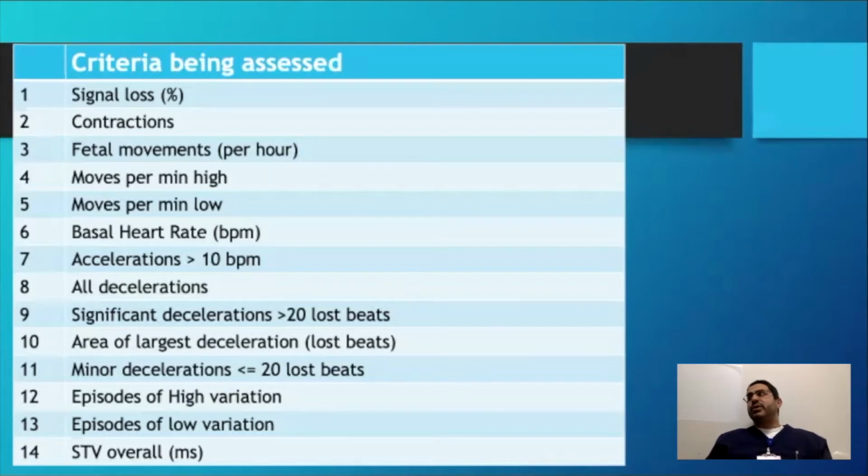Accurate or not, well, the reality is that the most the baby is going to move is the moment you start stimulating it. Okay, so the moment you put the trace on, you're going to feel more movements. It may be that this baby's not going to move any further, and that's only the 2 movements that you get for the entire hour. But that's the caveat. That's what it reports when it says 12 movements. It's per hour. Okay. Movements per high and movements per low. So the number of movements in the episodes of high variation and the number of movements in low variation.